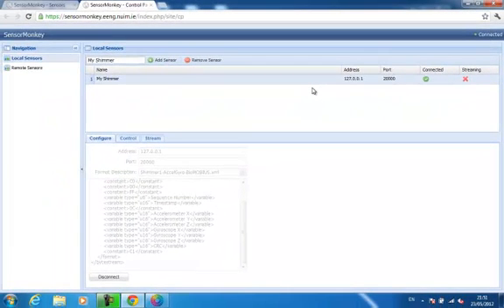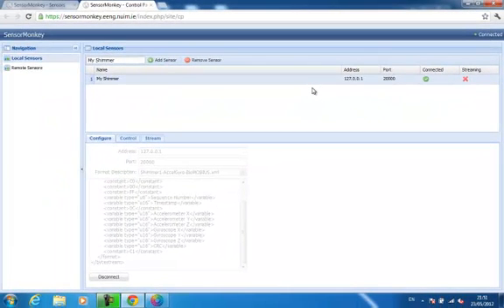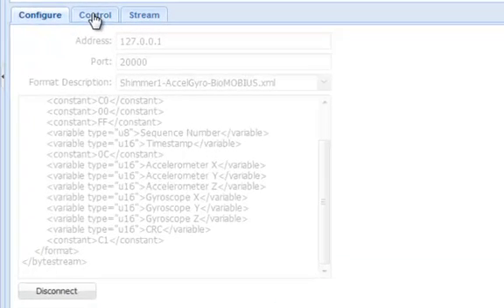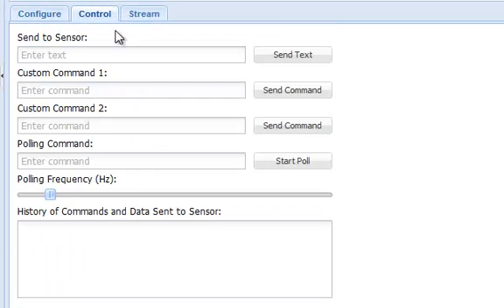By default, Shimmers do not begin sampling data until they are explicitly instructed to do so. I can use the Control tab to send commands to the Shimmer. The particular commands used by the Shimmer are documented in the source code for the Biomobius AccelGyro firmware. They are also listed at the top of the format description file should you forget what they are.